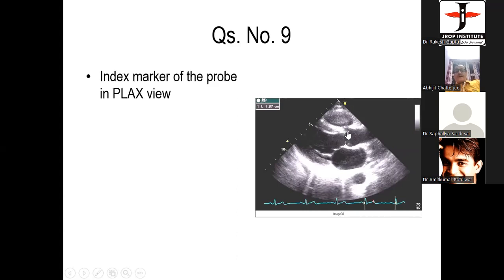And can you see the interventricular septum to the left? Yes, sir. What blood vessel supplies the interventricular septum? The medial basal is supplied by RCA. No, it is always LAD and the septal perforator of the LAD because it perforates the substance of the interventricular septum.